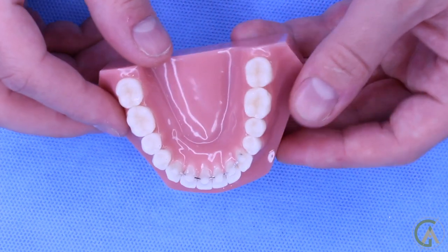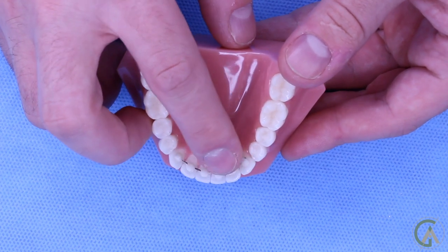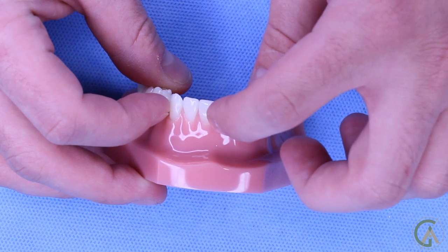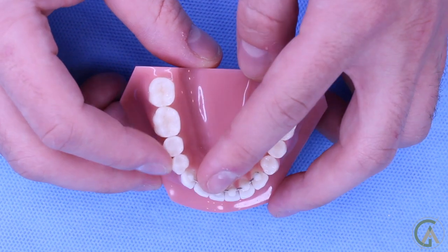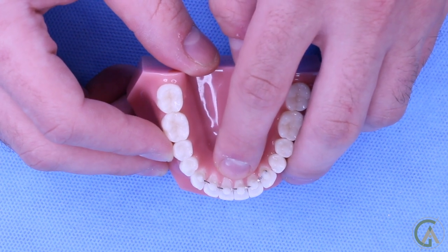The next type is a fixed lingual retainer. These are pretty tough to clean because floss can't go down through them — the wire prevents it. There's a wire that runs along the tongue side of the teeth, held in with little dots of cement on each tooth. You have to thread the floss between the contact points to clean the gum margin and under the wire. To clean around these, you have to use something like super floss or a floss threader to get around the wire, go under the gums, and clean them really well.